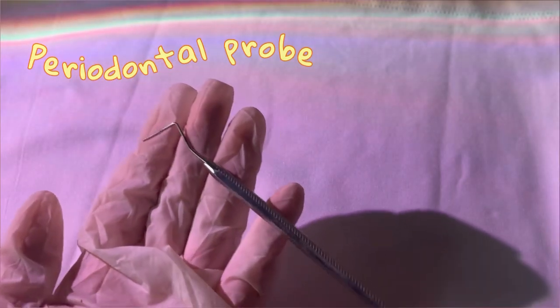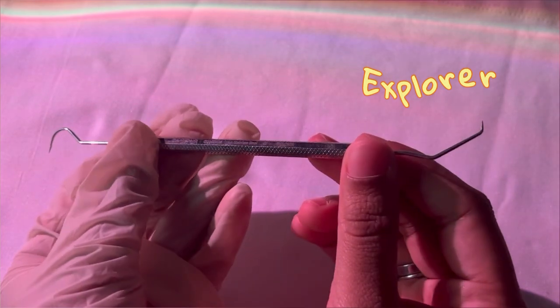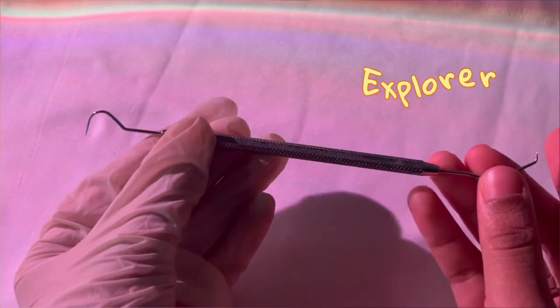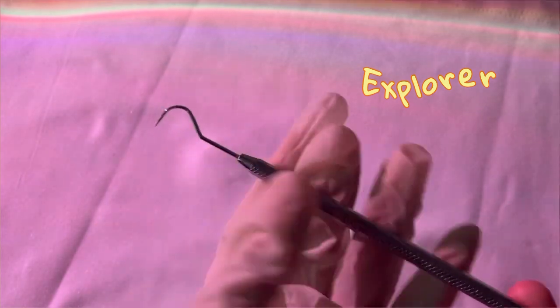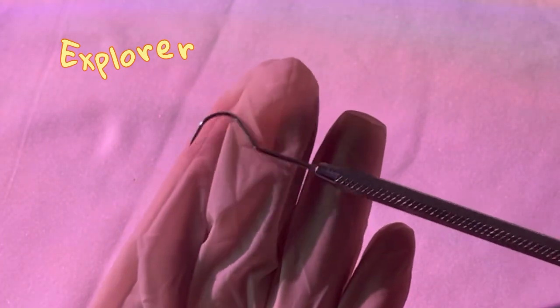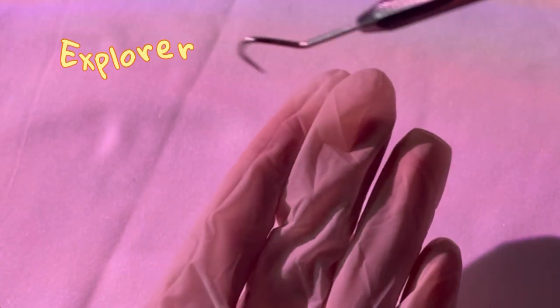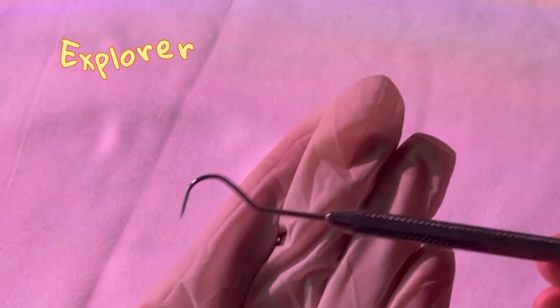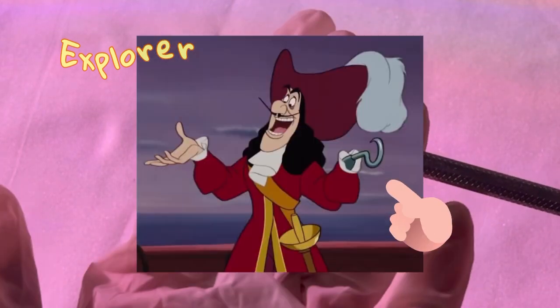Next up we have the explorer — not Dora the Explorer, but a dental explorer used in dentistry. Both sides have sharp, pointy edges, but one side has a hook-shaped appearance. This hook is used to explore inside the mouth and check if there are any cavities. You can remember it easily: it looks like a hook, and explorers have a hook.